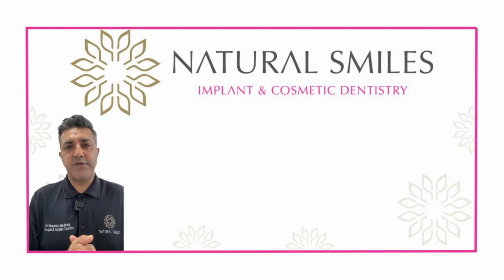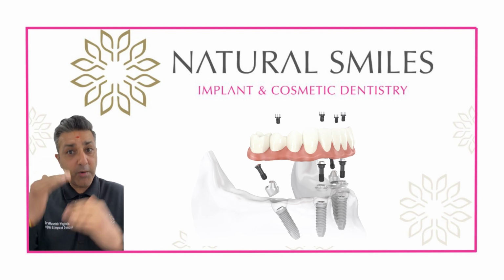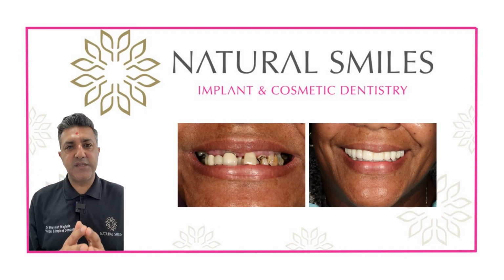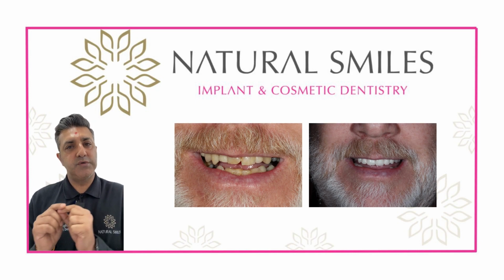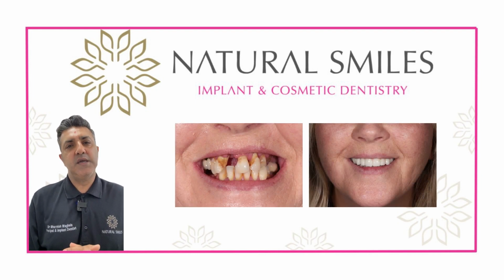So in that scenario, we are able to replace a whole set of teeth in upper jaw, lower jaw, or both jaws. And what we're doing there is we're able to replace the full set of teeth using dental implants, and these teeth are not removable, so they are fixed into position. And there are a couple of ways we can do that.